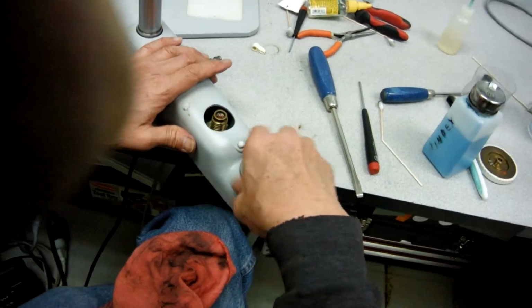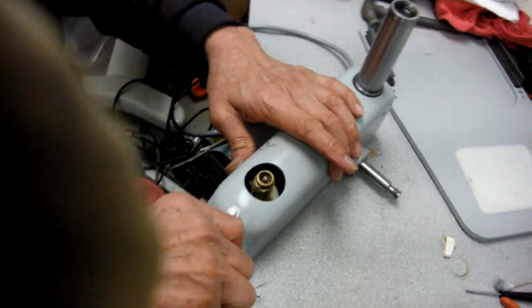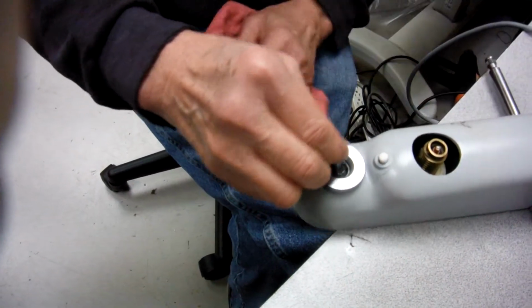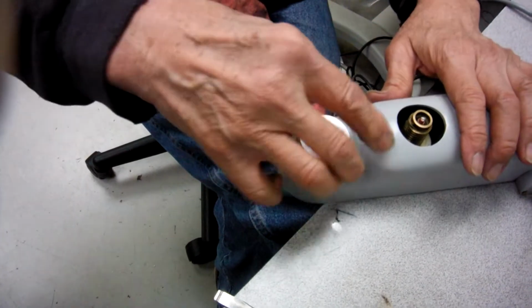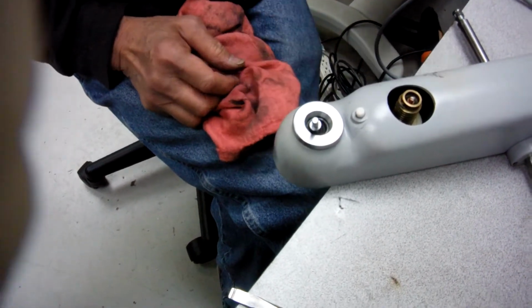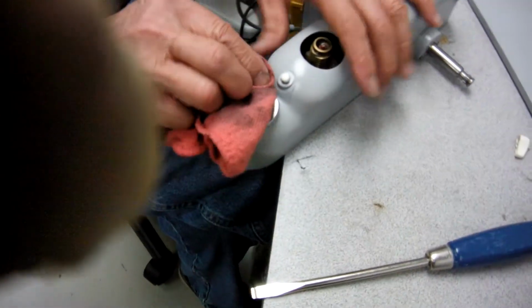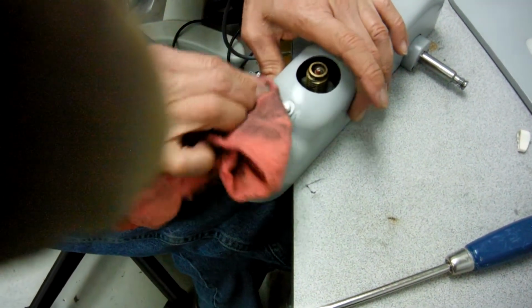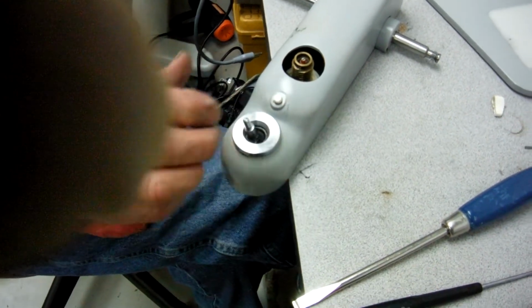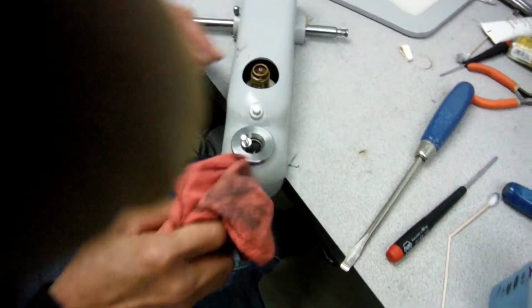With that in there now, lock this one, and see, right now it's hard to move this. See, it doesn't even move. That's why this one has it. You all might not have it, so don't worry about it, because if you don't have it, it doesn't mean it's no good. It is good, because this one maybe wore out. That's why they add that part in there.